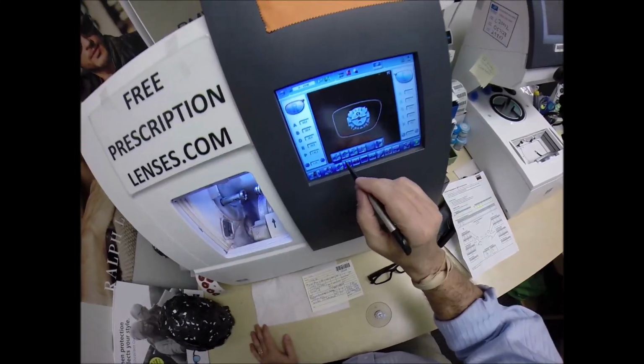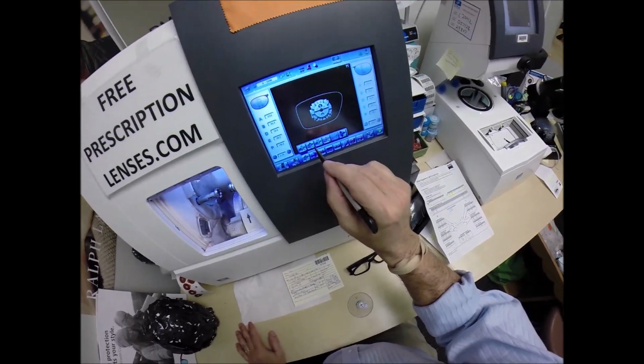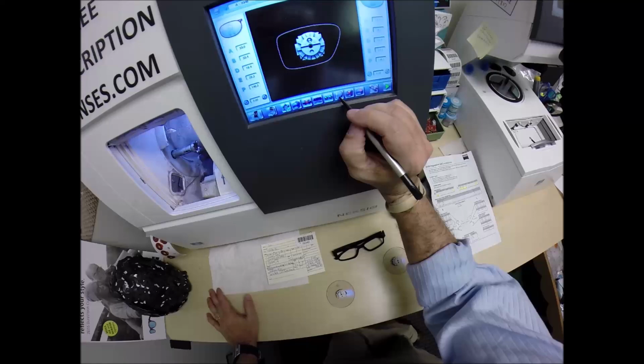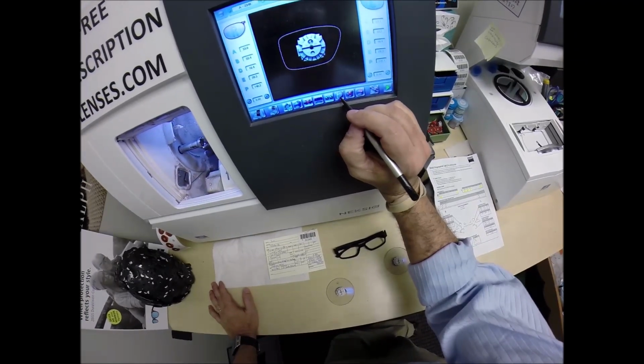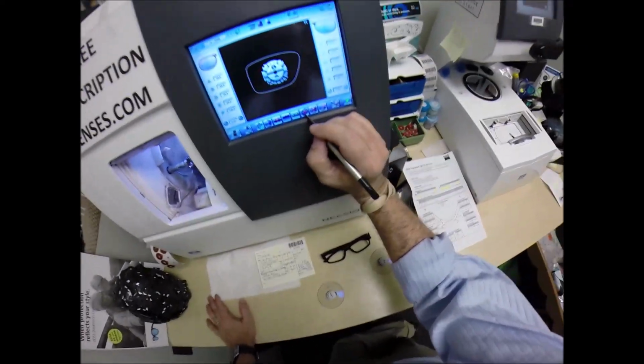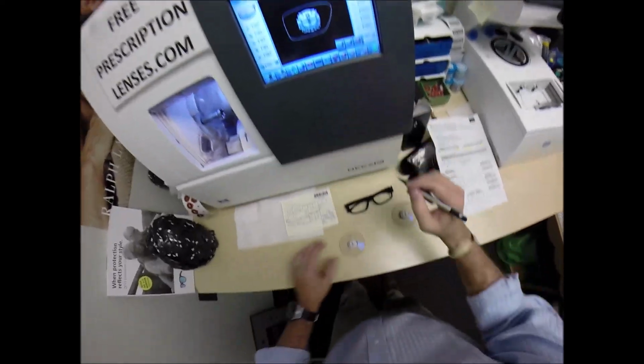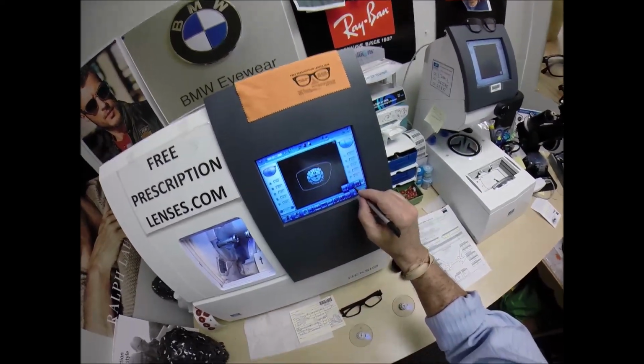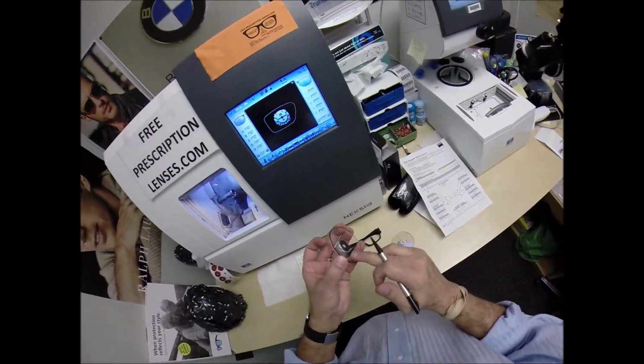These are polycarbonate lenses. If they were plastic, high index plastic or Trivex, I would select that material. I'm not going to polish the edge of the lens, which is a default setting for polycarbonate, because it's not going to be seen in this frame. I'm not going to put a safety bevel on the front convex surface of the lens because it's going to be seated inside, but I will put one on the rear concave surface of the lens.